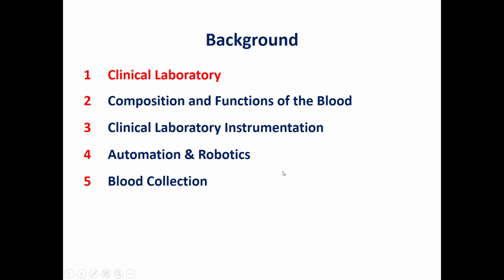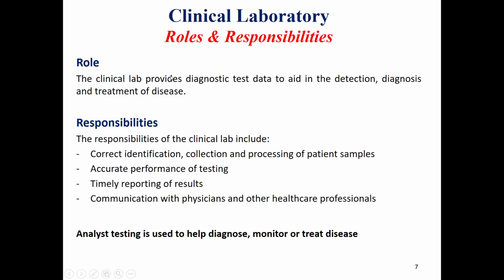So now we'll start with this background, as I have said before. We will start with the first point in the background, which is the clinical laboratory: what is a clinical laboratory, what are the different sections of this clinical laboratory, and so on. A clinical laboratory provides diagnostic test data to aid in the detection, diagnosis, and treatment of disease. What are the responsibilities of a clinical laboratory?